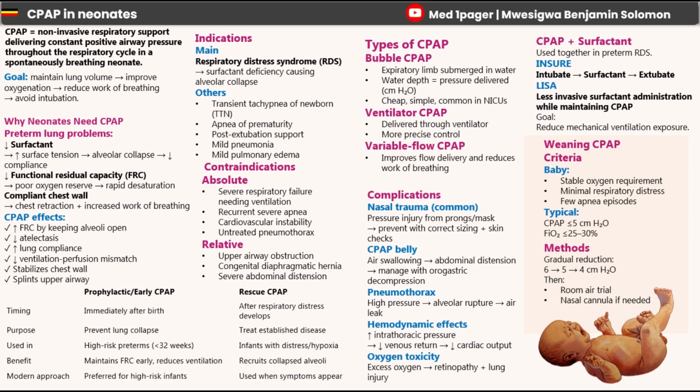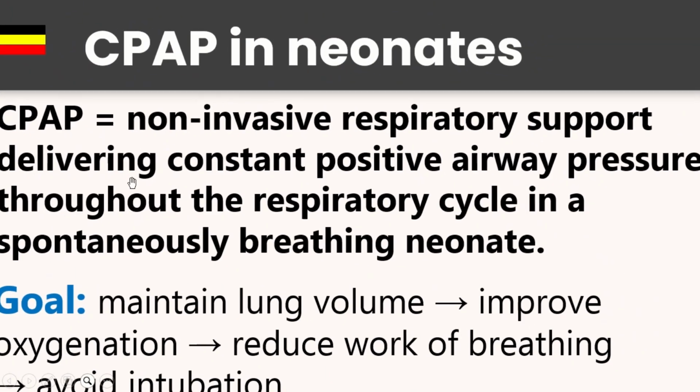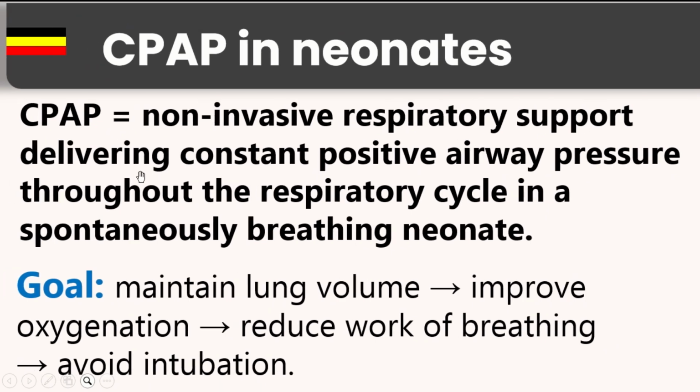And let's get started. So CPAP is a non-invasive respiratory support. This means we are not intubating. Remember, there is what we call intubation, where a tube is put into the trachea and then oxygen is delivered via a ventilator. But with CPAP, it's going to be non-invasive, and we're going to deliver a constant positive airway pressure throughout the respiratory cycle in a spontaneously breathing neonate. And this is very important because if someone is not breathing spontaneously, then they cannot qualify for CPAP.